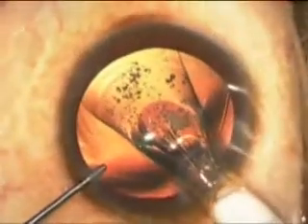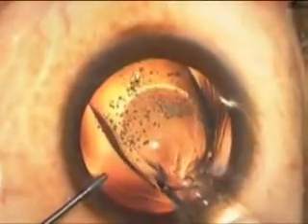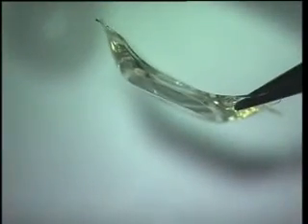To conclude, Visian ICL is a good option not only for the treatment of moderate to high myopia, but also in other conditions such as stabilized keratoconus. It is important for the operating surgeon to be aware of different complications and various modalities of management to have happy outcomes.